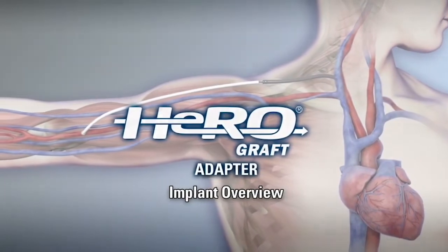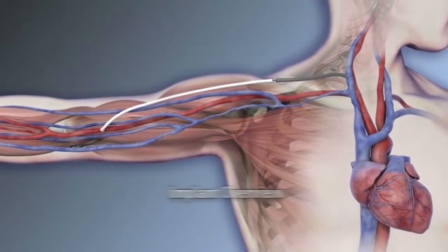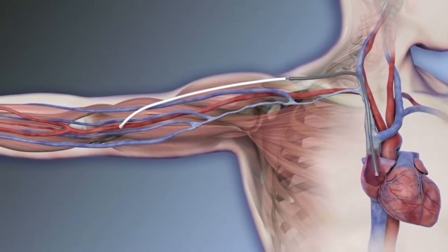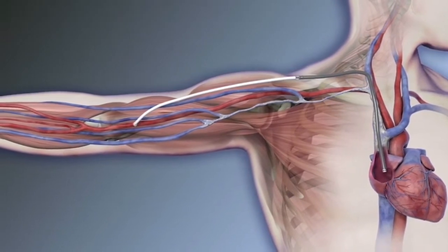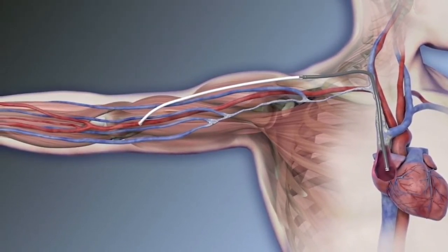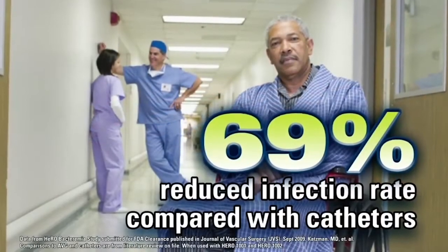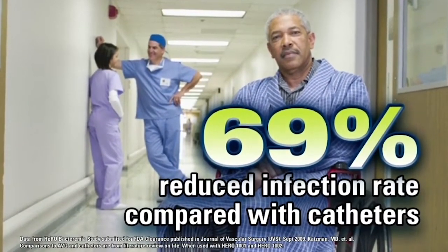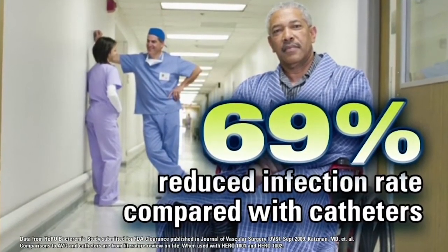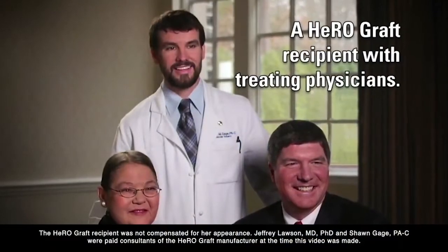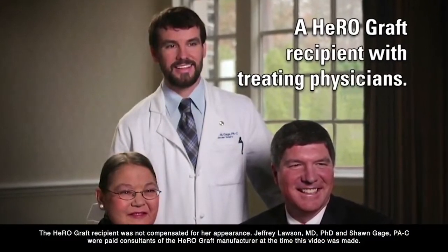HeroGraft Adapter. The HeroGraft is a fully subcutaneous permanent access for end-stage renal disease patients on hemodialysis. HeroGraft is clinically proven to reduce infection by 69% and improve adequacy of dialysis when compared to central venous catheters.